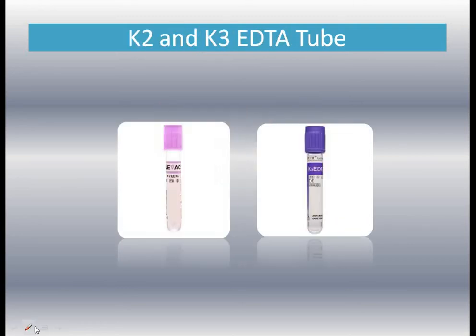6. Commonly two types of EDTA tubes are used, one is K2 EDTA and the other is K3 EDTA. Most commonly, K2 EDTA is preferred for counting blood cells and other hematological studies. Hence, the K2 is sprayed inside the walls of the tubes. But the K3 tube contains liquid, so the dilution problem will lead to a 1 to 2% error in reports and quantification studies. As we discussed for sodium citrate tubes, this anticoagulant also inhibits coagulation by chelating calcium. Unlike sodium citrate, EDTA is not reversible.